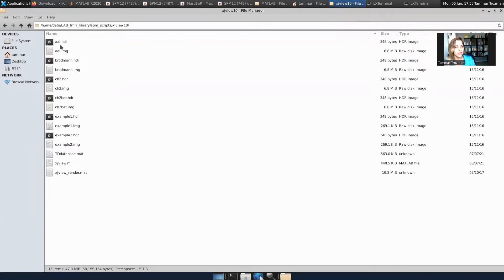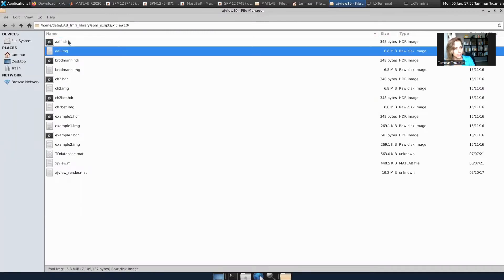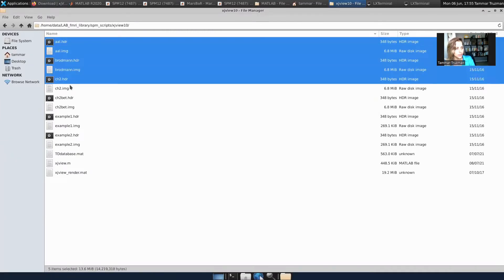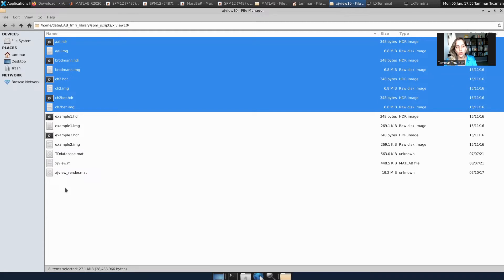I took these files: AAL header and image, Brodmann header and image, CH2 header and image, and CH2bet header and image. And I have to either transfer them or copy them to the canonical folder of SPM.